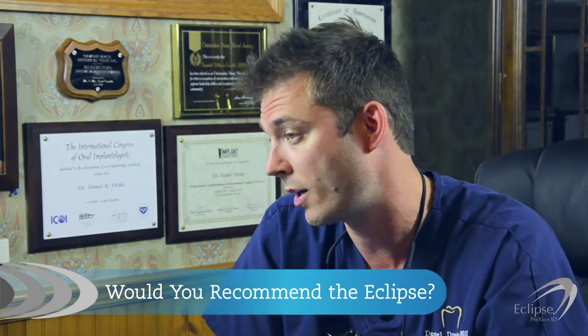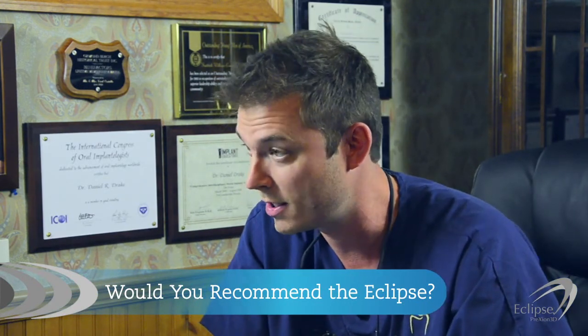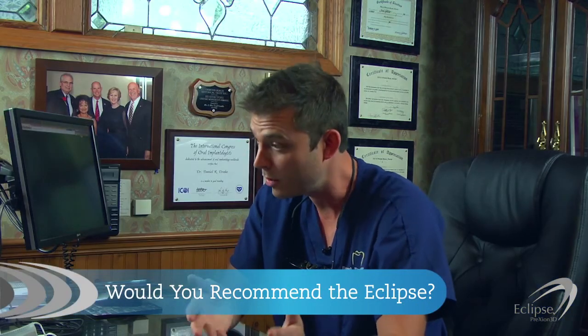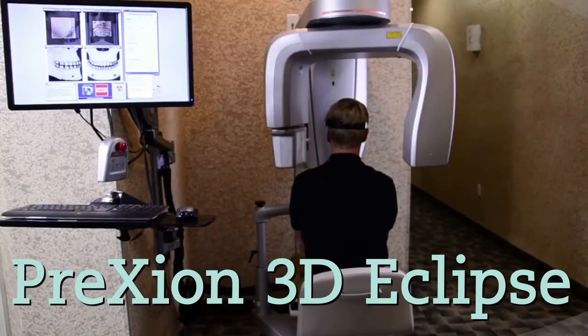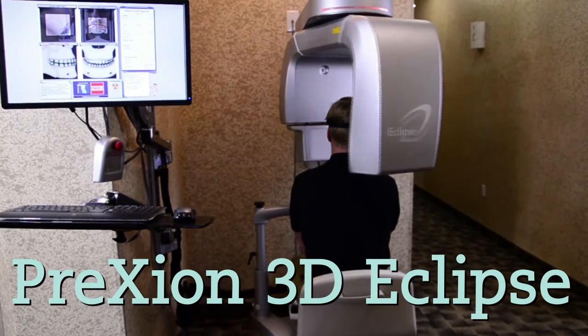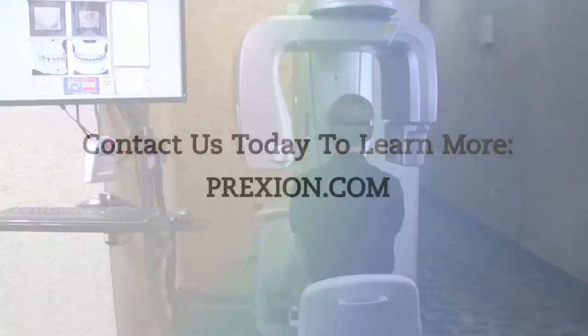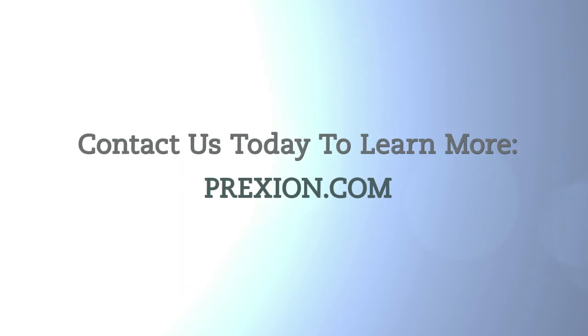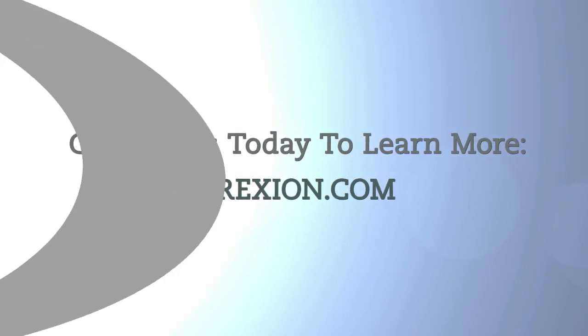At the end of the day, when you're talking with the patient and showing them this, you want them to understand that too. Because if they understand it, then they're going to pursue treatment. That's the best part about the Prexion scanner. The Prexion 3D Eclipse — confidence and clarity at an affordable price. Contact us to learn more about how the Prexion 3D Eclipse can improve your peace of mind.